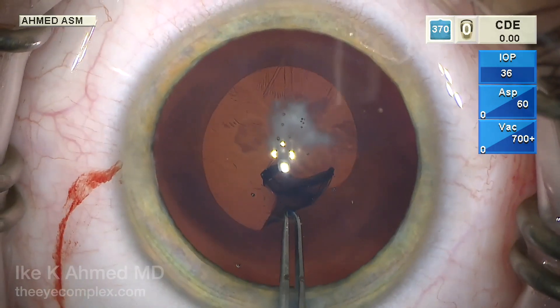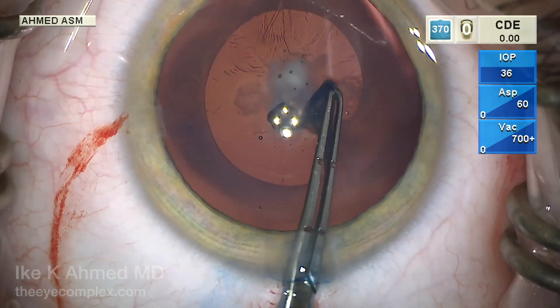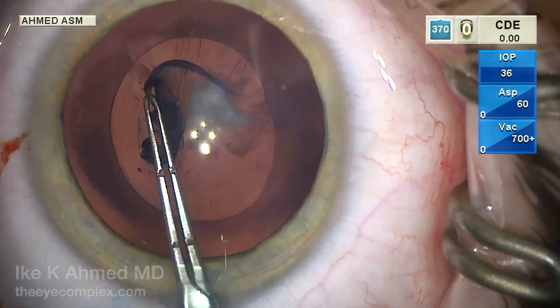Again, checking to make sure the size of the capsulorhexis should be about 5.5 millimeters here. At the end of the capsulorhexis, just turning into a bit of a shearing and stretching technique to finalize it.